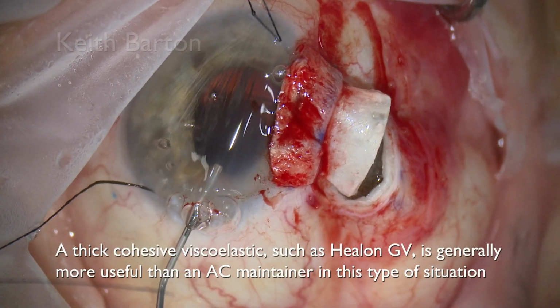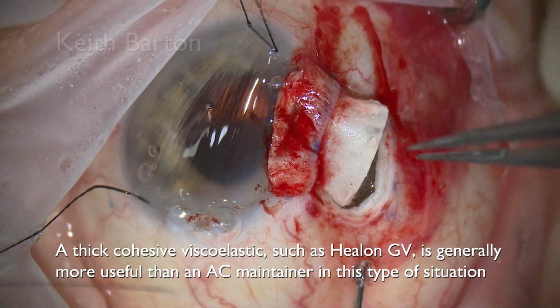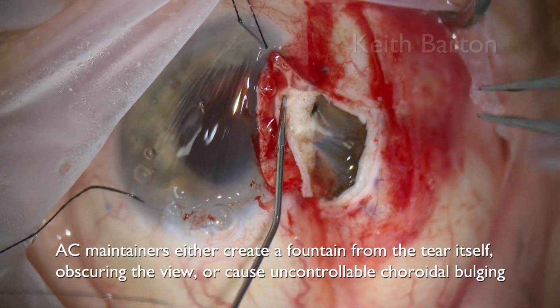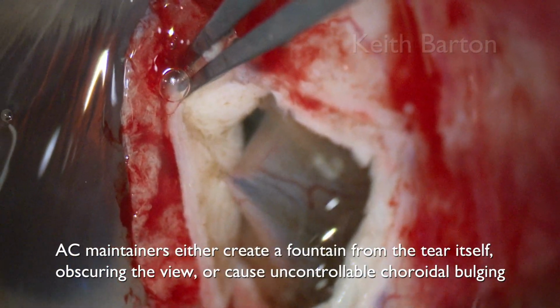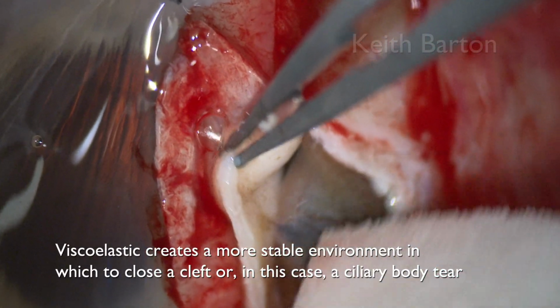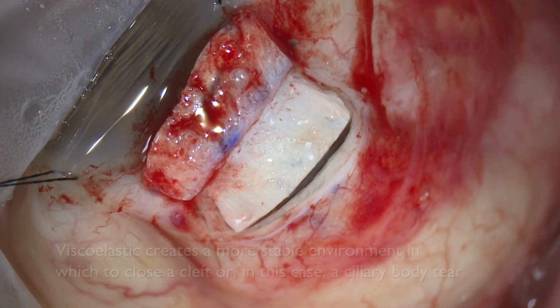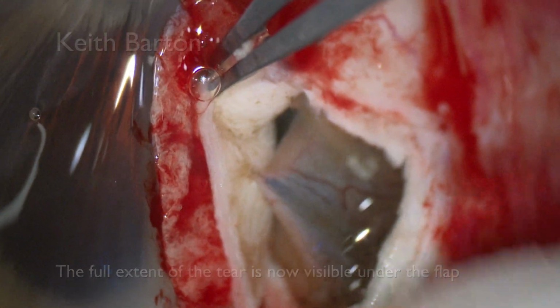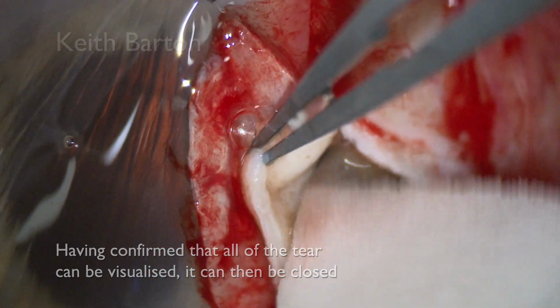A thick cohesive viscoelastic such as Healon GV is generally more useful than an AC maintainer in this situation. AC maintainers either create a fountain from the tear itself, obscuring the view, or cause uncontrollable choroidal bulging. Viscoelastic creates a more stable environment in which to close a cleft, or, in this case, a ciliary body tear. The full extent of the tear is now visible under the flap. Having confirmed that all of the tear can be visualized, it can then be closed.